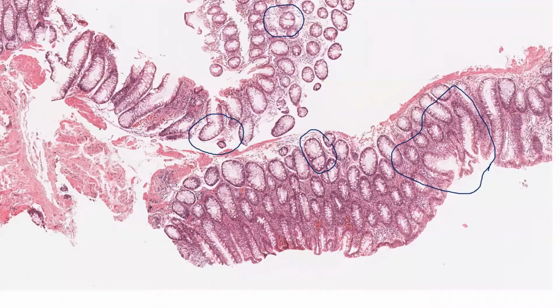Crohn's disease is a chronic colitis, and by definition, the majority of chronic colitis will have the crypt architectural distortion. Yes, Crohn's disease, unless it is fulminant and superinfected and has some CMV on top or whatever, then it can cause marked architectural distortion.